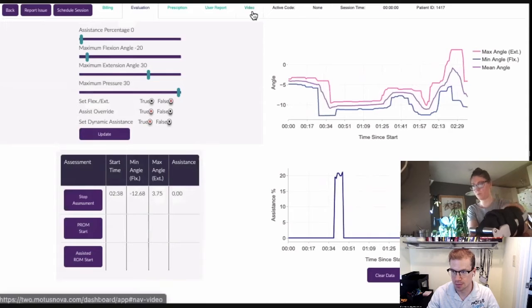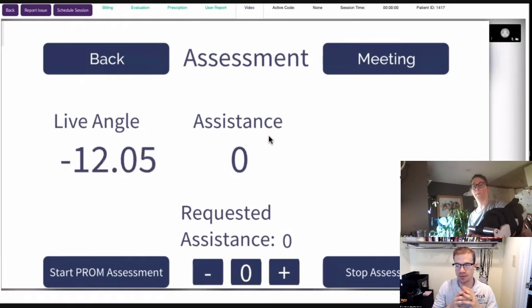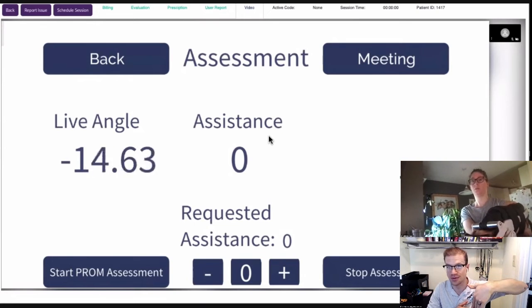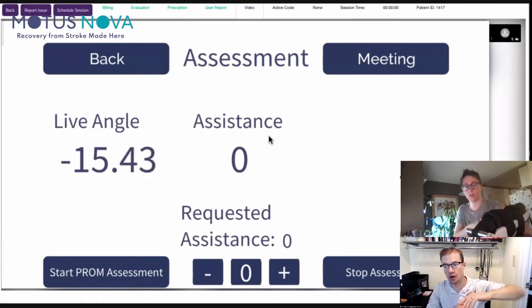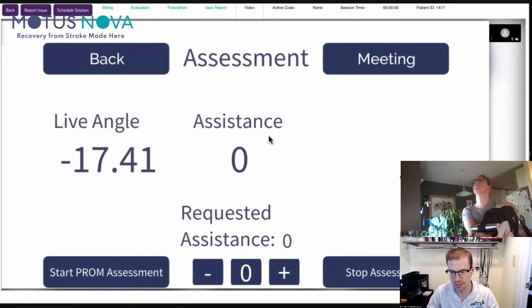Give me just a second here. Let's have you try to move up into extension. So try to move up as far as you can. Whenever you're moving up into extension, you're actually going down into flexion. You see that? Sorry. No, that's okay. That's okay. This is good to know. And so then go ahead and try your best to go up into extension as far as you can for me. Go up as far as you can.